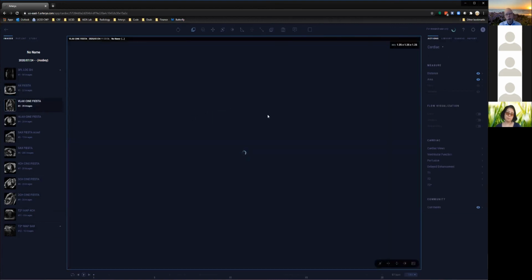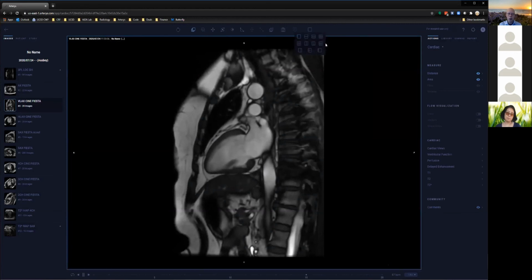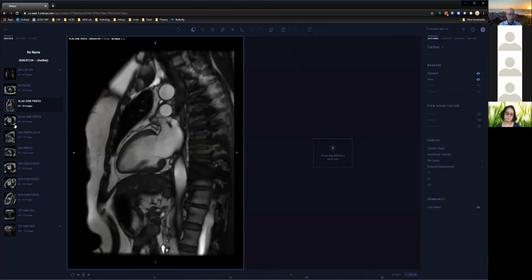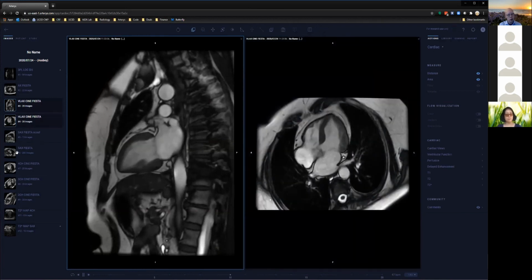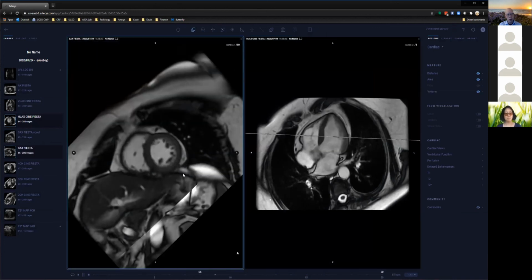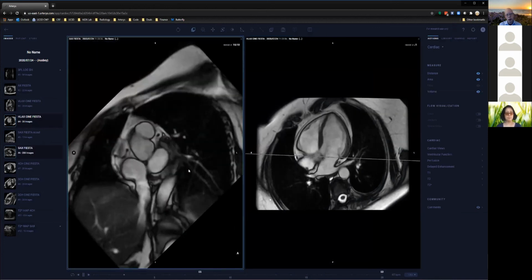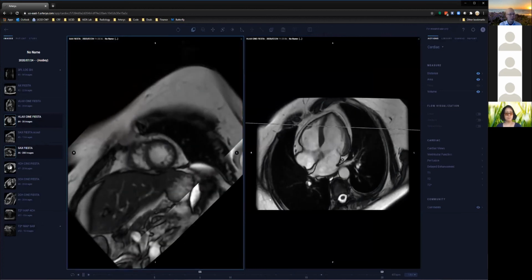So this is just our standard non-contrast iron protocol, and we have just basically function for these patients. But I was really pleased by the image quality that we're now getting pretty routinely on this scanner, which is 20 years old, but it looks like a brand new scanner. It's pretty cool.